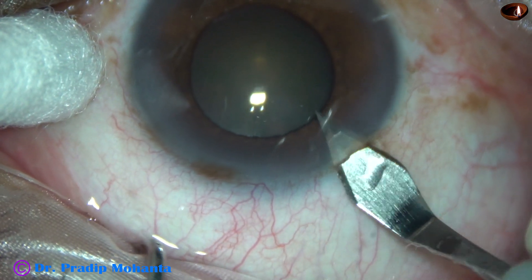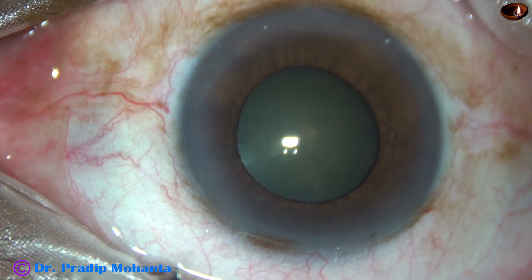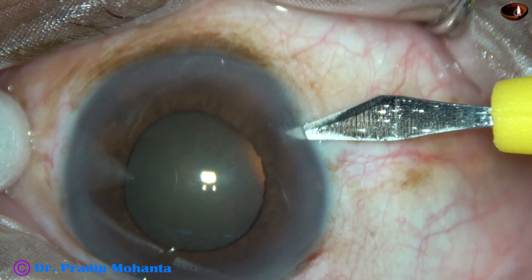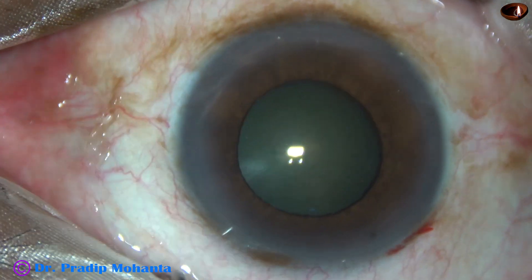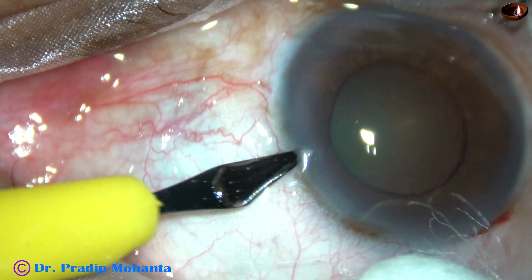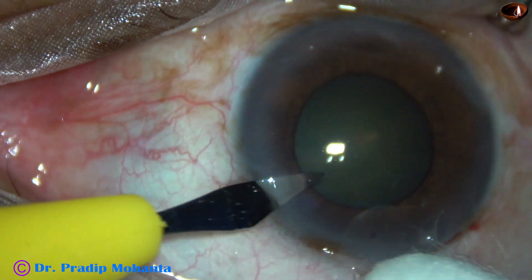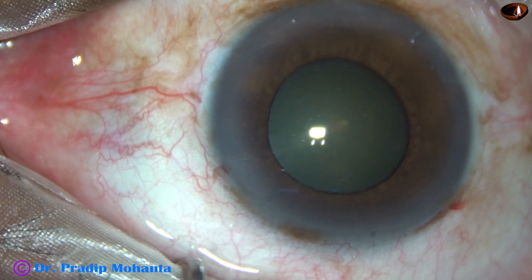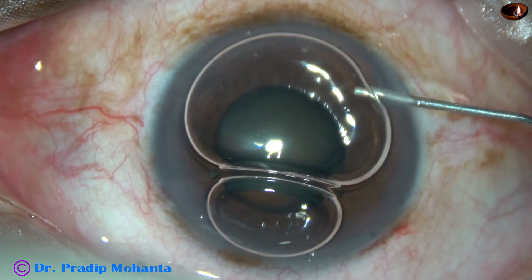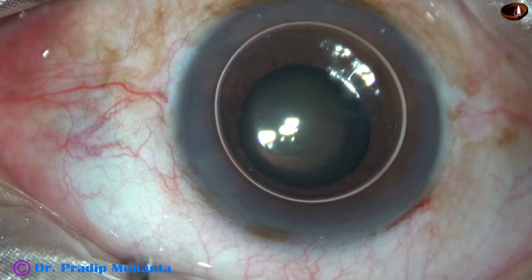In this case, we are going to see management of intraoperative miosis. In this case, the pupil has dilated to about 4 mm or 4.5 mm. And my plan is to use adrenaline first and see if it dilates to appropriate size.